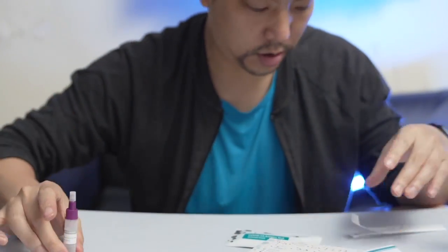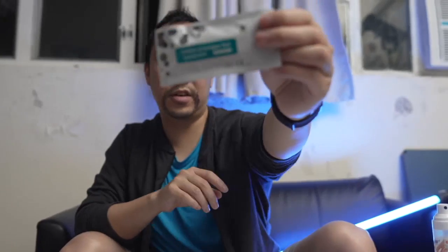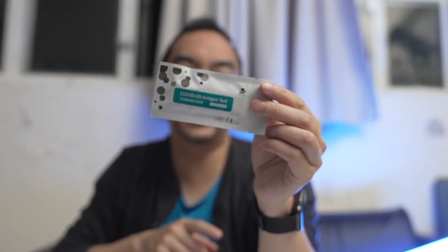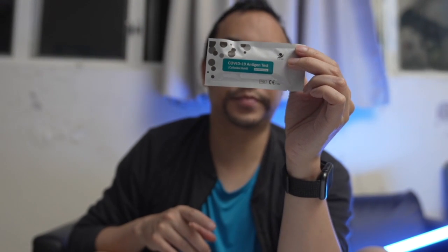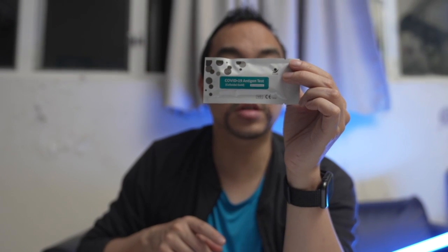Do I have to wait? No, you're gonna do it straight away. So these you don't need. Now in here I have a COVID antigen test, colloidal gold. I have no idea what that means. This is manufactured in Guangdong, China, by CMC Medical Devices and Drugs.